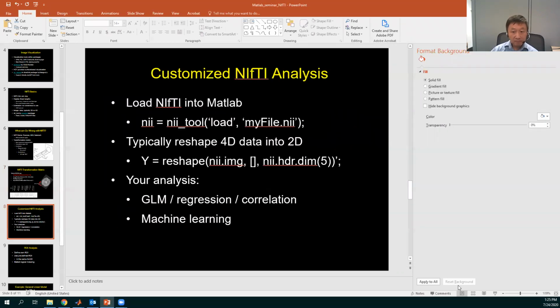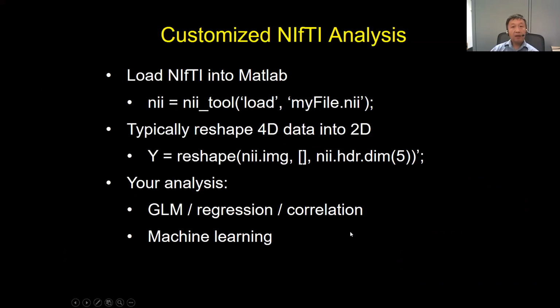All the major packages use NIfTI format, and they deal with NIfTI format perfectly. Otherwise, we won't be able to use them. But when we do some customized NIfTI analysis, we need to read NIfTI into Matlab or another package by ourselves, because oftentimes those packages won't cover those special analyses. In those cases, we will need something like Matlab. So this is load NIfTI, using the NIfTI tool to load the file name, like I just did.